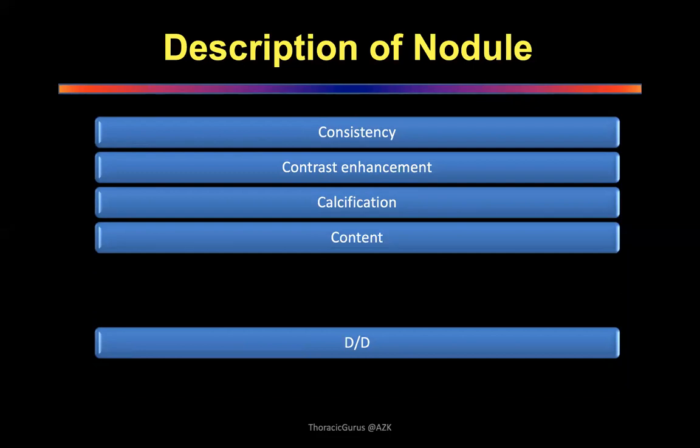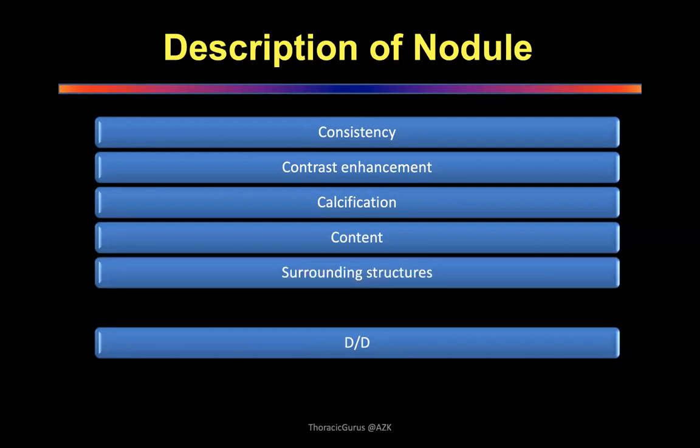Are you seeing a daughter cyst within the cyst, or are you seeing something floating within the cyst, or are you seeing fluid within the cyst? Talk about the surrounding structures. So what is the effect of the cyst on the surrounding structures?